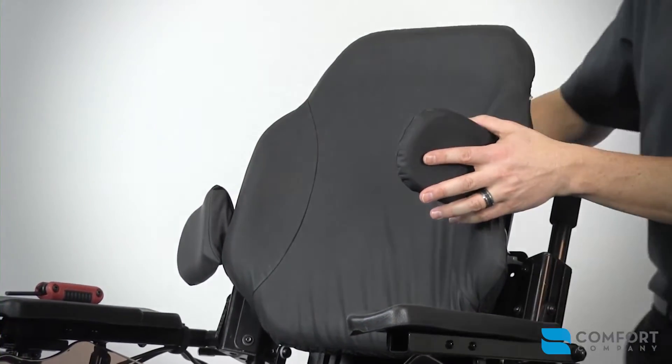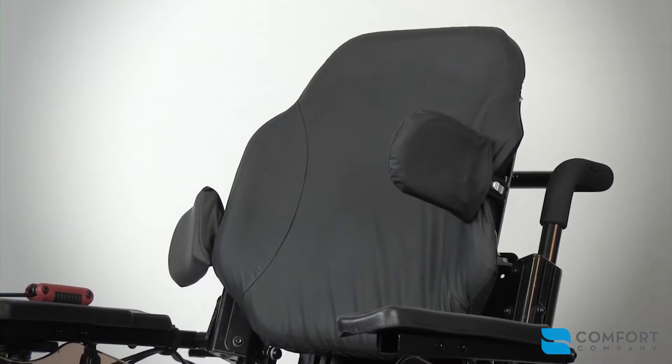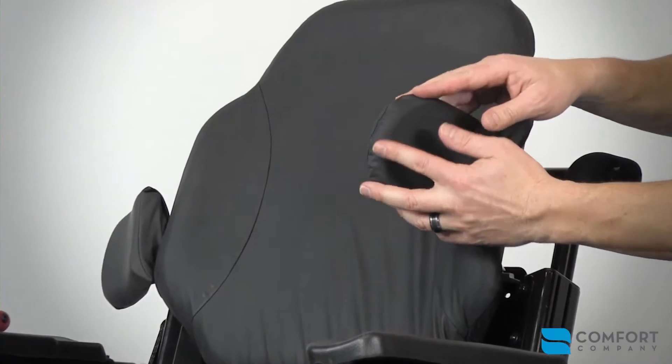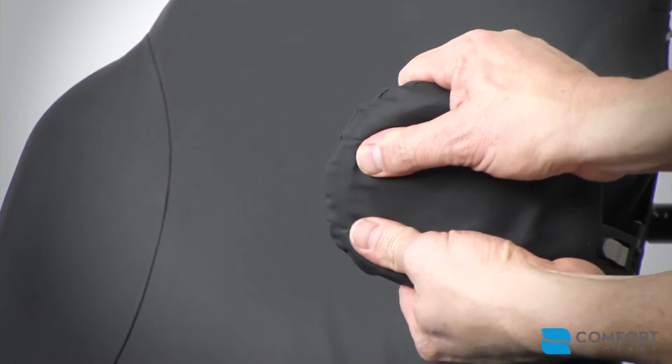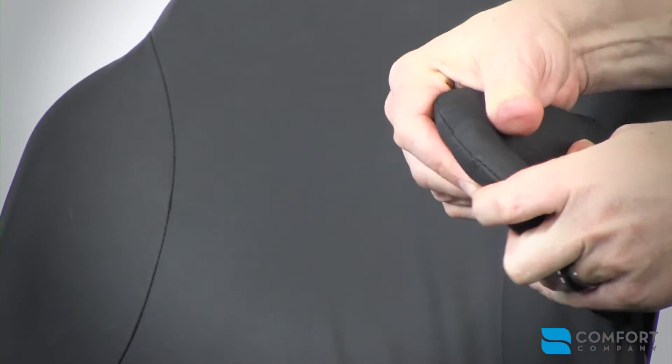One of the last features I'd like to show you is the moldable feature. You can get our pads in a rigid or moldable setup — these are moldable. Grab onto them and turn them into position wherever you need for your patient.